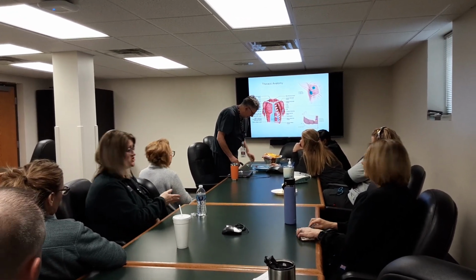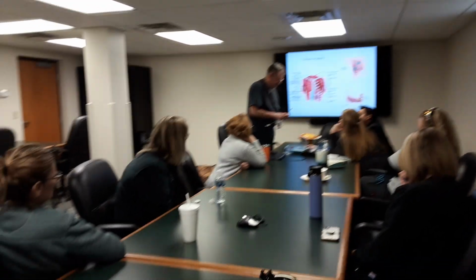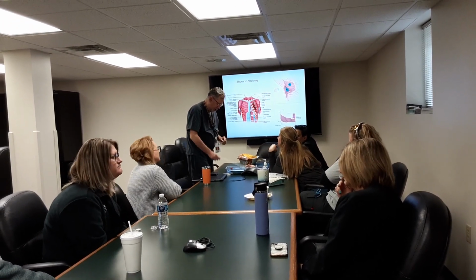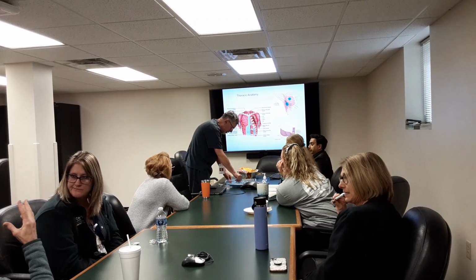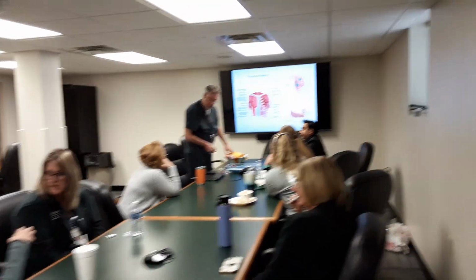But my questions are about managing. I wanna watch, because that's where we have the problem. It seems to be very subjective. I mean, just looking at this, we've raised the skin wheal, we'll use one of the smaller needles there. You put in 2 or 3 cc's of local. Insertion is much better.